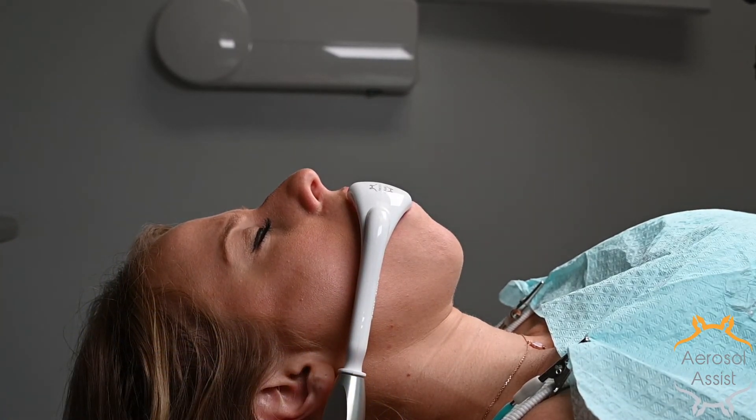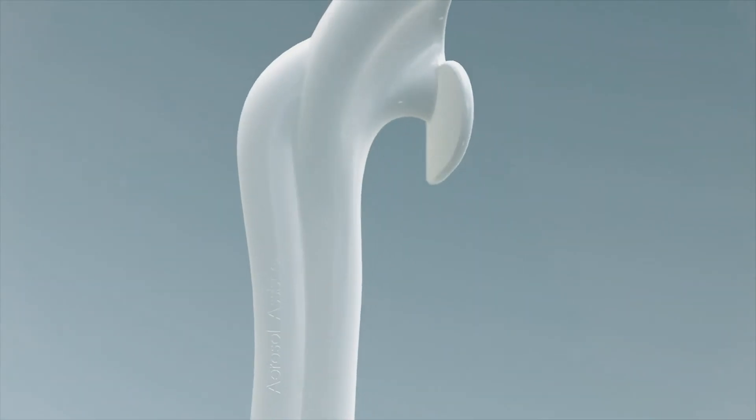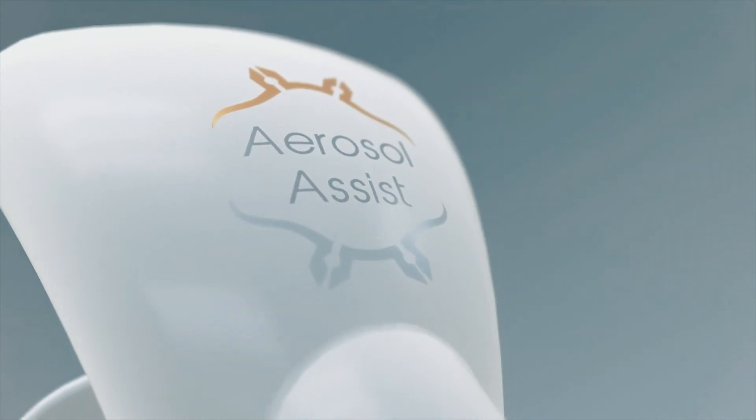When properly aligned, the buccal plate is comfortable for the patient while offering stability.